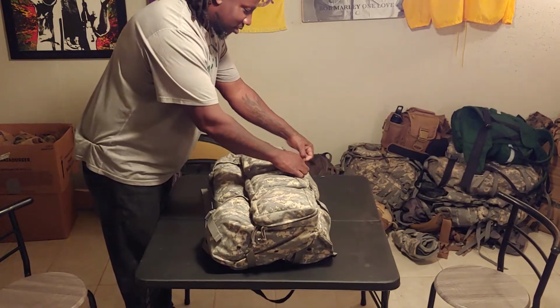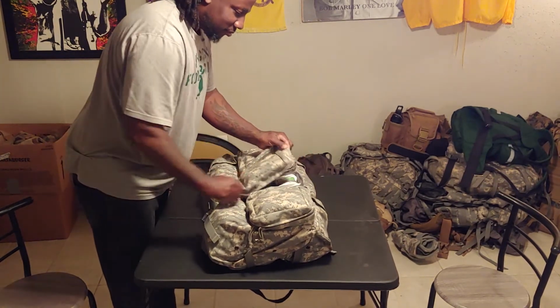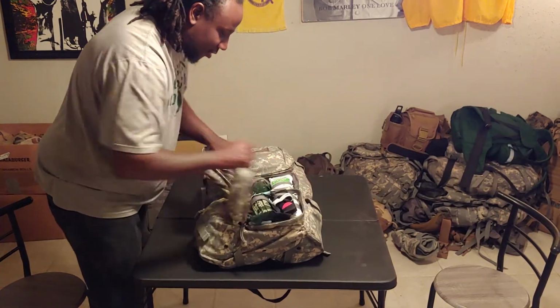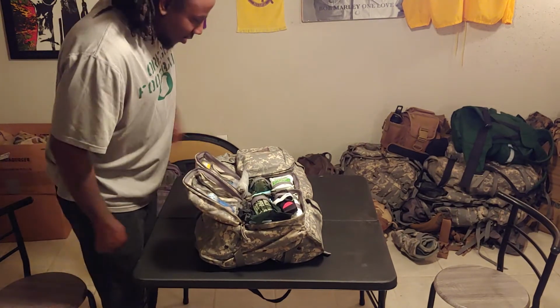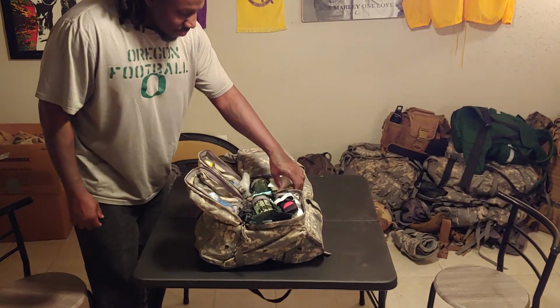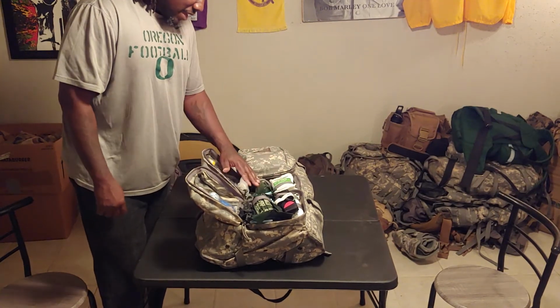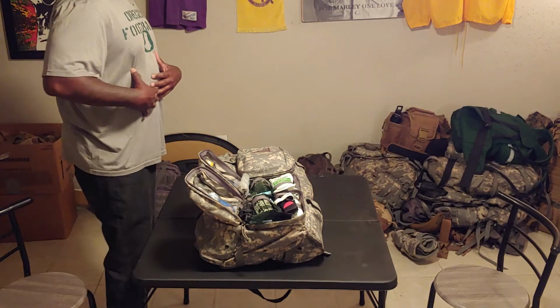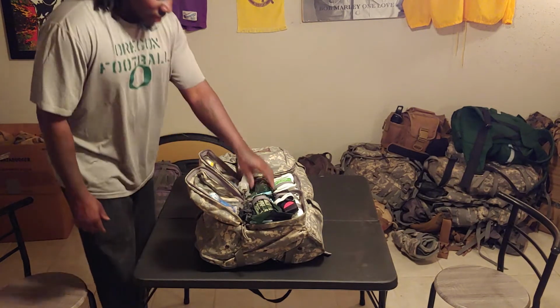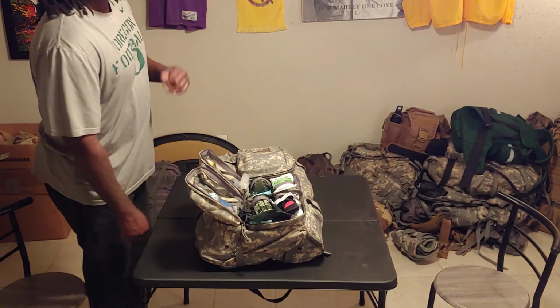And like I said, remember, this is designed for trauma, a blood event. Next pouch. Actually, we'll open up both of these at the same time for the sake of time, because they're just about identical. Dressing for blood clotting, stopping a wound that's bleeding. Take that, stuff it in there. An Israeli bandage. Also, if there's a stomach wound, stab wound, or bullet wound, you tape it, you wrap it around the stomach or leg. I think these are big enough. I think I have a 6 inch, a little bit bigger than 3 inches. I have a 3 inch in the little IFAK.